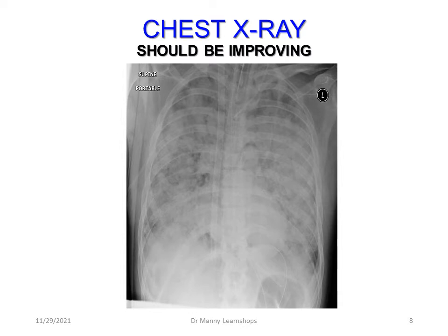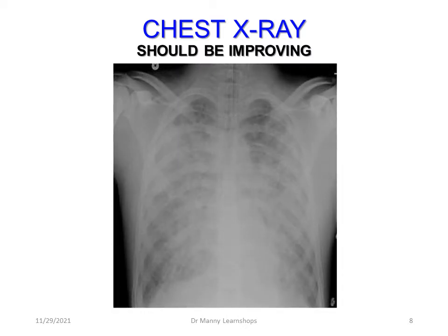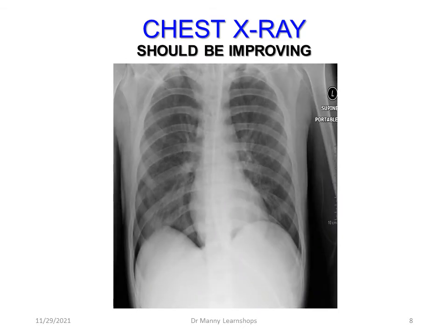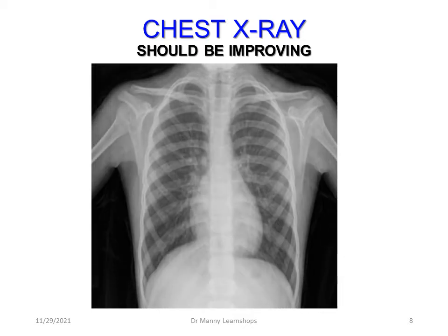Chest x-ray should also be improving. This is demonstrating ARDS. Should be improving. Still not perfect. Improved air entry. Lungs are becoming blacker. Perfect. Hopefully, clinically, they're the same. Because remember, the chest x-ray gets sicker last compared to the clinical picture in a patient with acute respiratory distress syndrome, ARDS. That's what we want, to see an improvement both clinically and through investigations such as blood gases, chest x-ray.